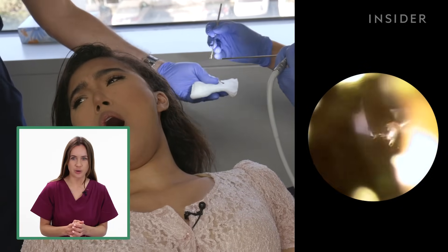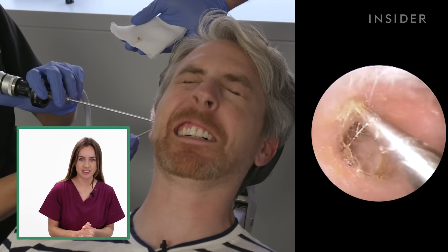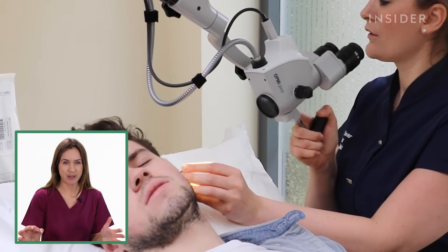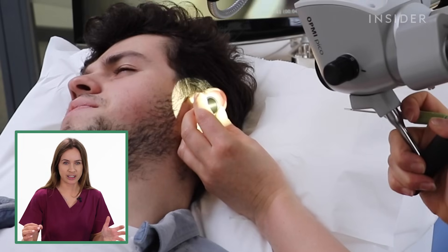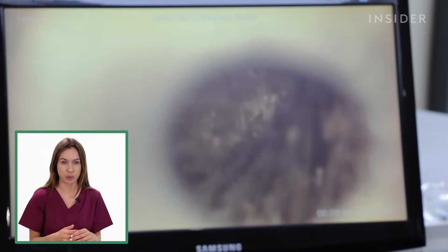I think that is quite a big overreaction to how much pain or how uncomfortable that actually is. So you can see here they've got a speculum, and that is something they use to keep the ear open so they can see the earwax as best as possible.